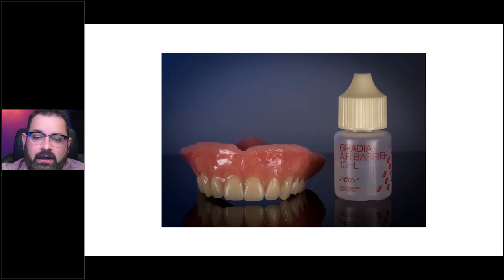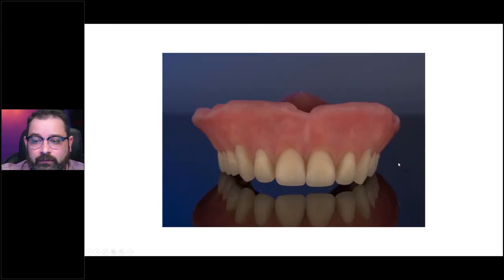Once you've tack cured everything, you want to apply some kind of air barrier in order for that sticky layer of inhibition to be removed chemically. You can use ultrasound gel — you're essentially trying to suffocate that layer and make sure no air gets to it so the stickiness goes away. If you're using a curing unit that has a vacuum chamber or a nitrogen chamber, that will replace the air barrier step and you won't have to worry about applying it.